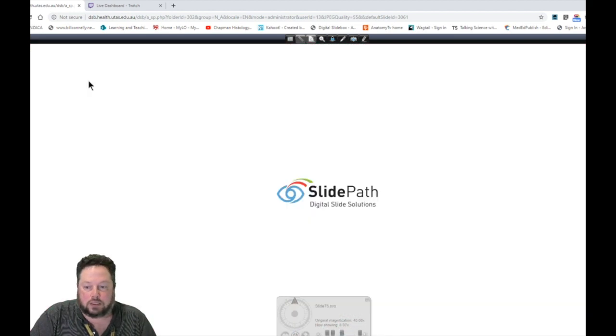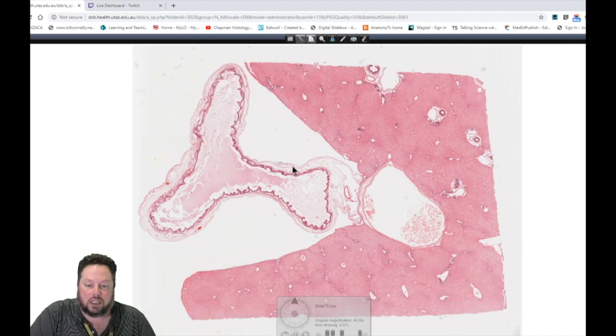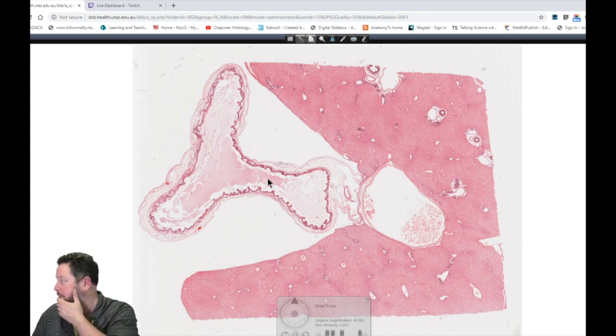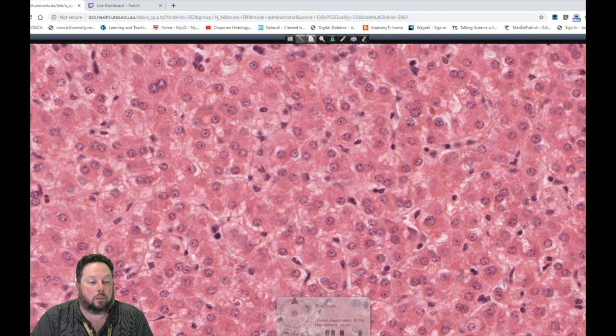All right. Does anyone have any questions about the liver before we begin our look at the gallbladder? So I do. Yeah. So you said in the pig that the stroma is quite well defined and it helps you see the structure. So when confronted with the human liver, what's the decision tree that you would go through to decide that you were in the liver? Is that something that you can talk about?